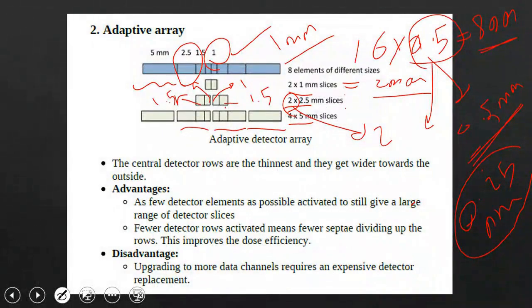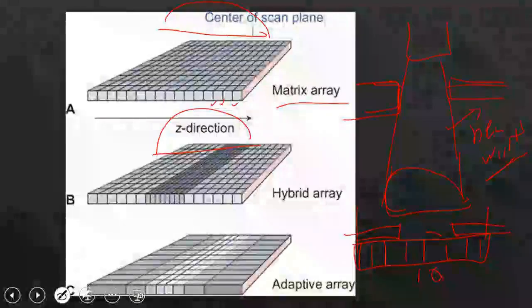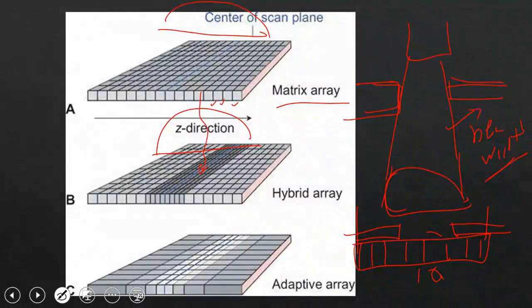But the question here is, where is the position of the 2.5 millimeters for me? I mean, when I say 1.5 millimeters, is it at the center of my beam? If the beam is here, is it better for me to work on it or to work on the lateral row of the detectors? The position of the beam in relation to the detector is vital as it determines the accuracy and reliability of the readings obtained. Understanding these configurations and their implications is essential for optimal performance.